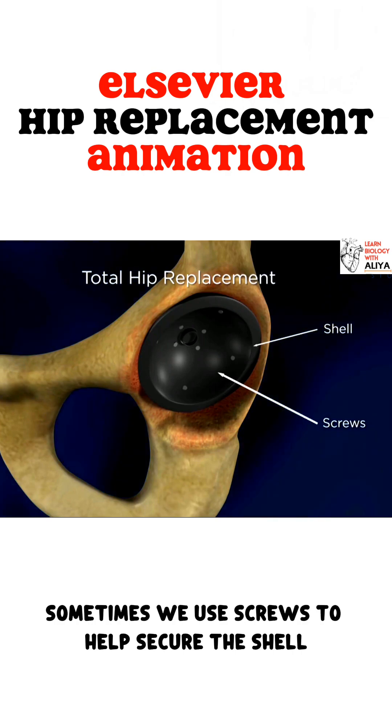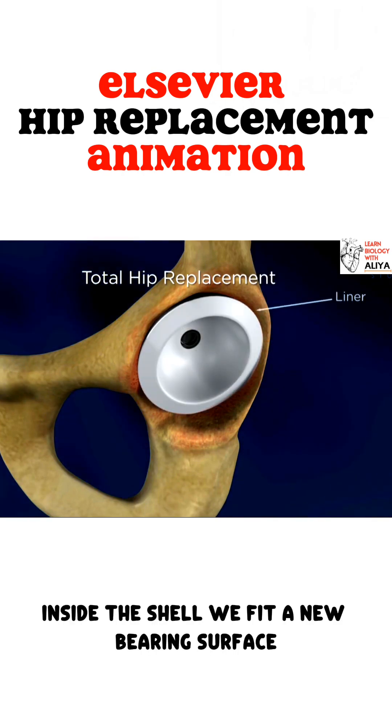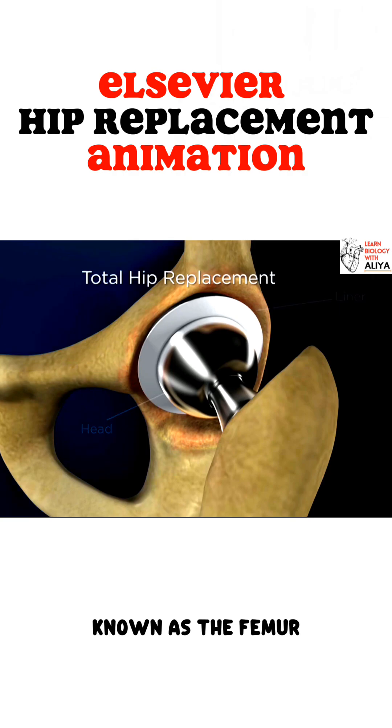Sometimes we use screws to help secure the shell until bone can grow into the metal implant. Inside the shell, we fit a new bearing surface. The other half of total hip surgery involves the upper leg bone, known as the femur.